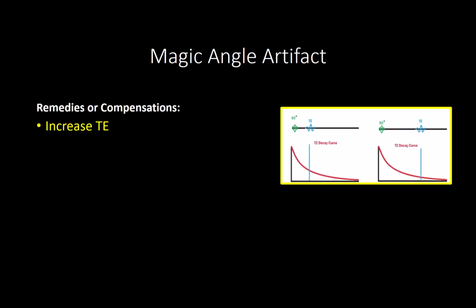Remedies or compensations for magic angle artifact. You can increase the TE because once again these artifacts occur with very short TE times.